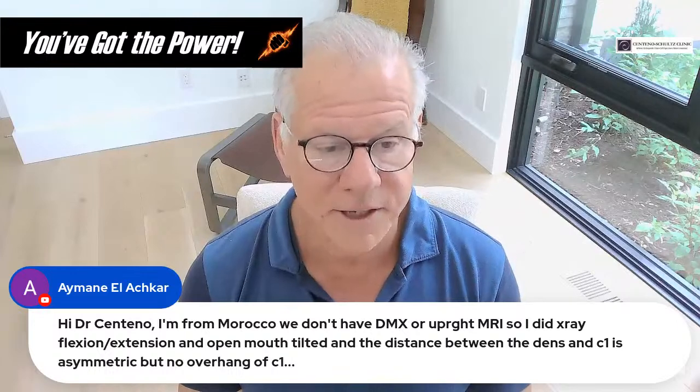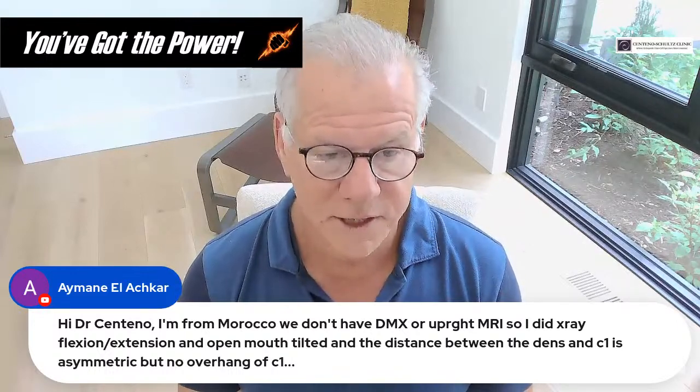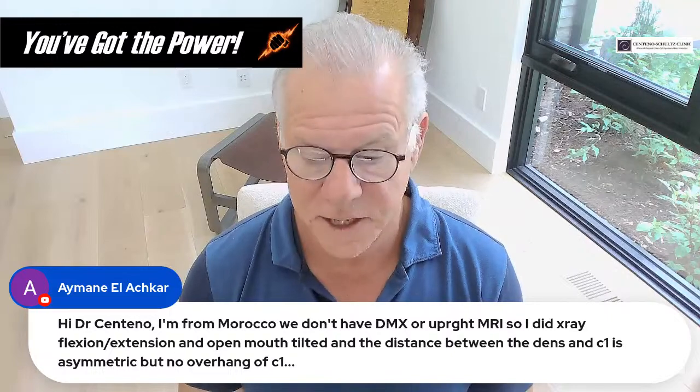Amin, I think, from Morocco: Hi Dr. Centeno. We don't have DMX or upright MRI. So I did X-ray flexion extension, open mouth, tilted, and the distance between the dens and C1 is asymmetric, but no overhang of C1.